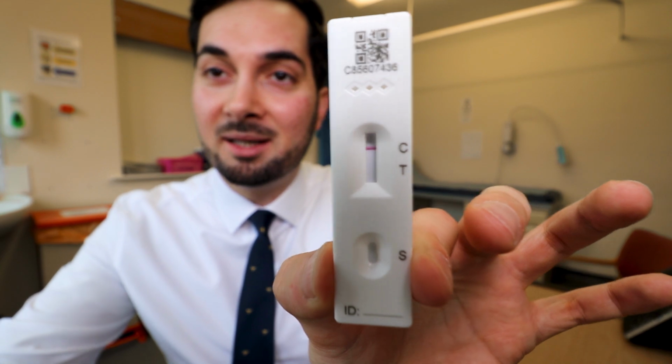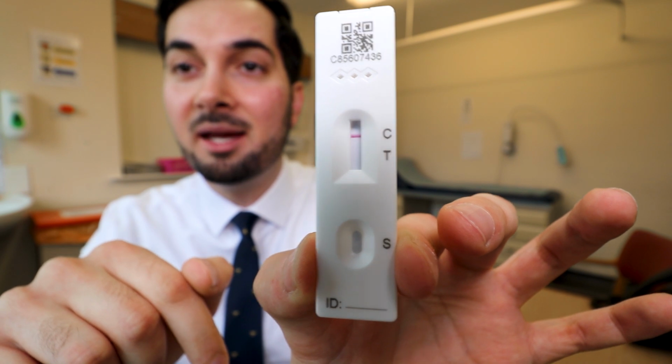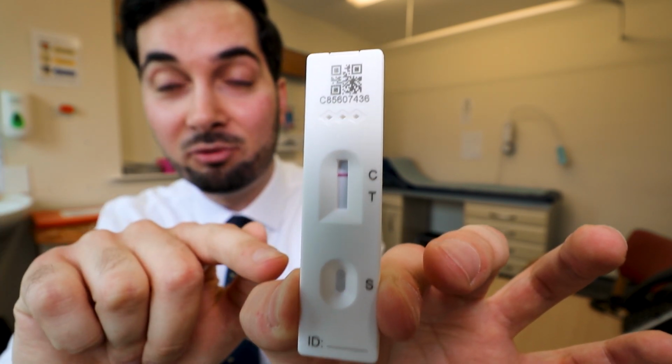test. Now, another thing to mention, which is really important, is when your test is void. So please read the information leaflet for your testing kit to know what indicates a void test. So if your test is void, you're gonna have to redo it all again. So for the IBD Innova one, it's pretty simple. So if we look at this again, I'll focus on it again. So if you didn't have any sort of lines on it, so it was clear, I think you can see that there. If it was clear with no lines on it, then it's void. Also, if it has nothing on the C and it's just a line on the T, for example, that also indicates a void result on the IBD Innova one. Please, let's focus again, but please remember, read that information leaflet for clarification.